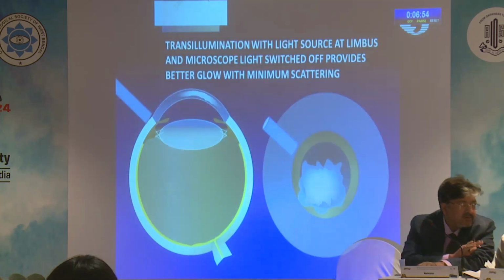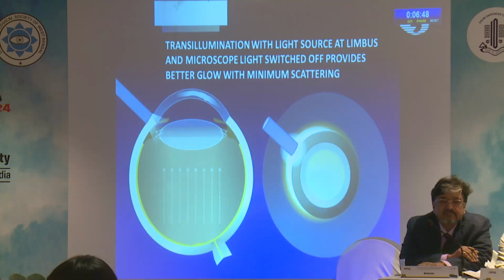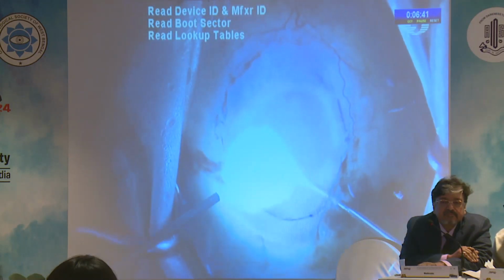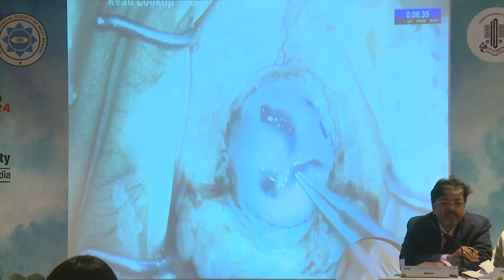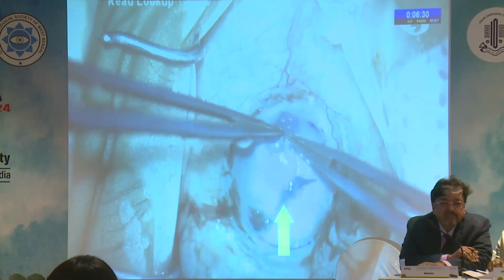The light pipe uses a focused light source and reduces scattering and reflection from corneal opacity. This enables better visualization for scoring and removing the host Descemet's membrane using the reverse Sinskey hook. The Descemet's in this case is removed in two parts. The parts are spread out and examined to analyze complete removal of Descemet's.